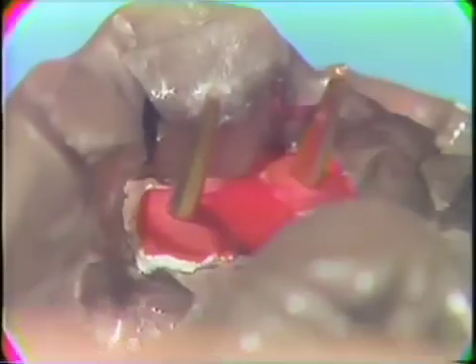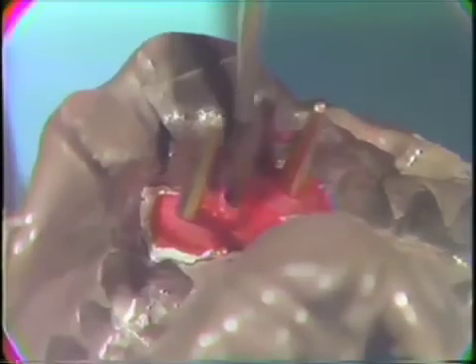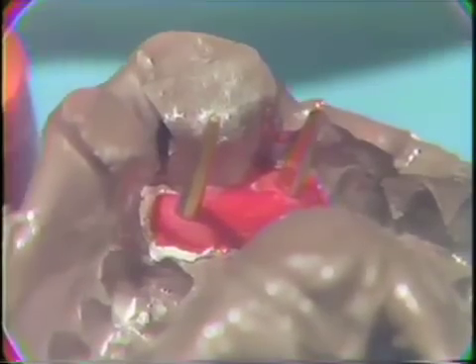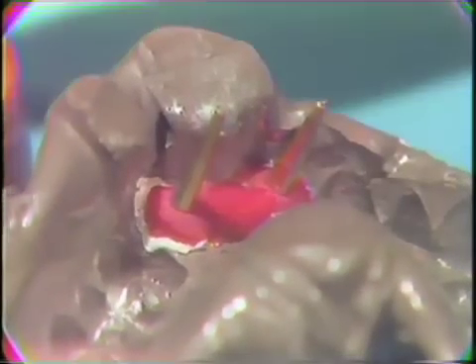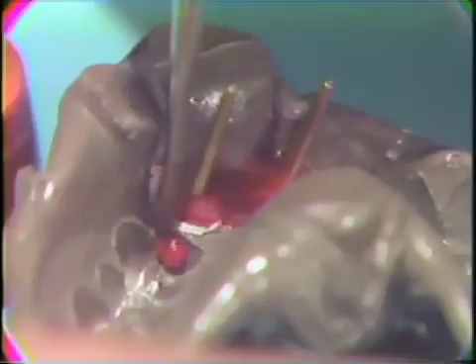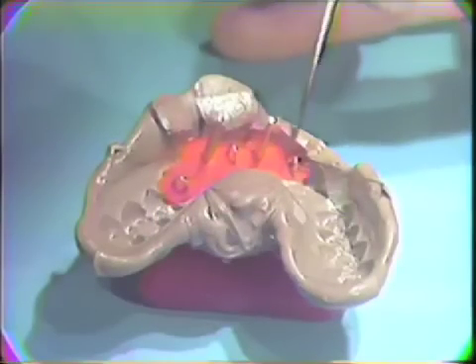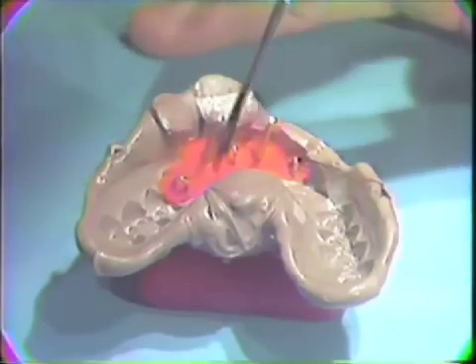Additional Duralay can then be added over the ridge and in the adjacent teeth. Also, loops, paper clips, or washers can be added to the Duralay to aid in retention. The Duralay is set, and you will note the loops for retention and the dowel pins in their proper position.